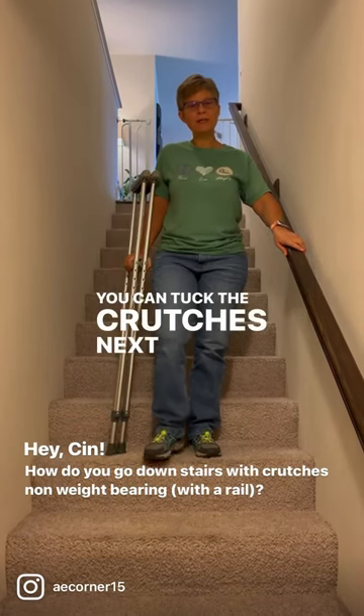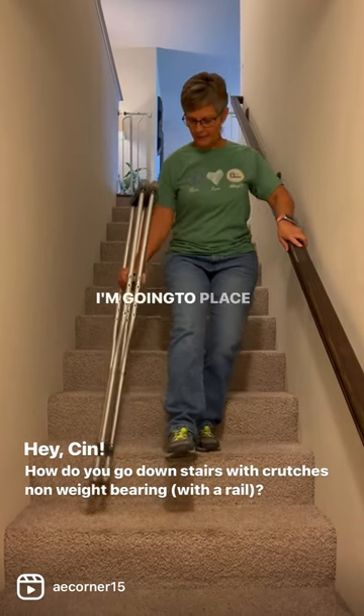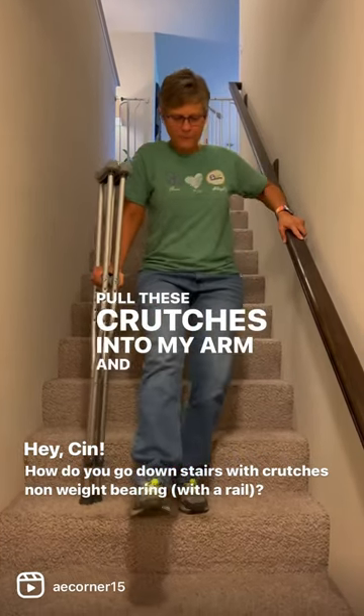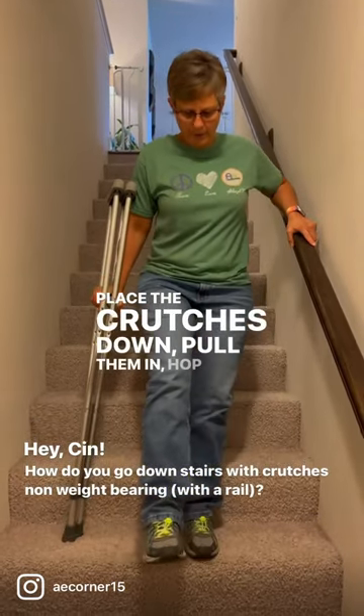You can tuck the crutches next to your side. This is my non-weight bearing leg. I'm going to place the crutches down, pull these crutches into my arm, and hop down with my good leg. Place the crutches down, pull them in, hop down.